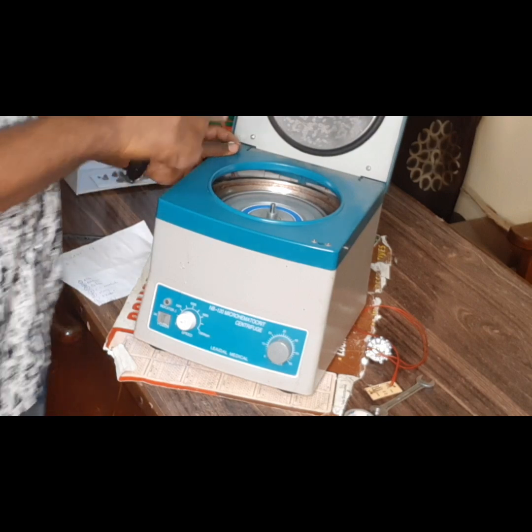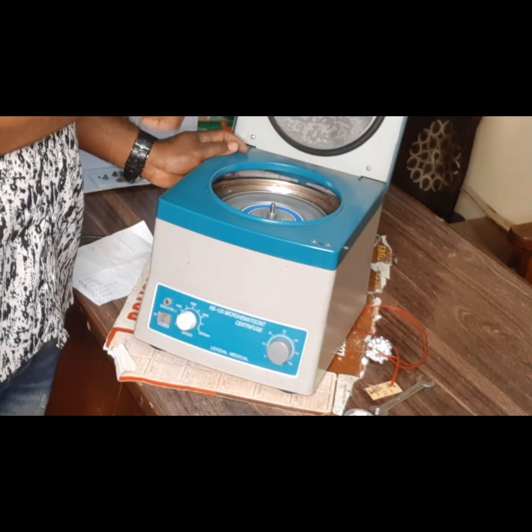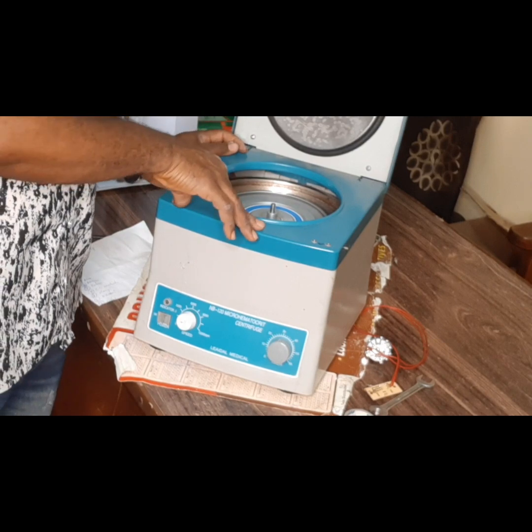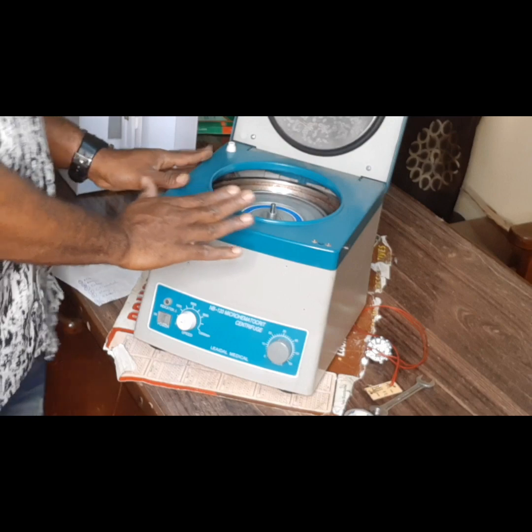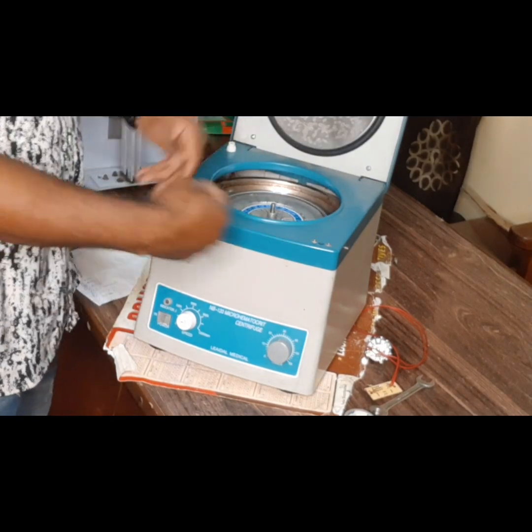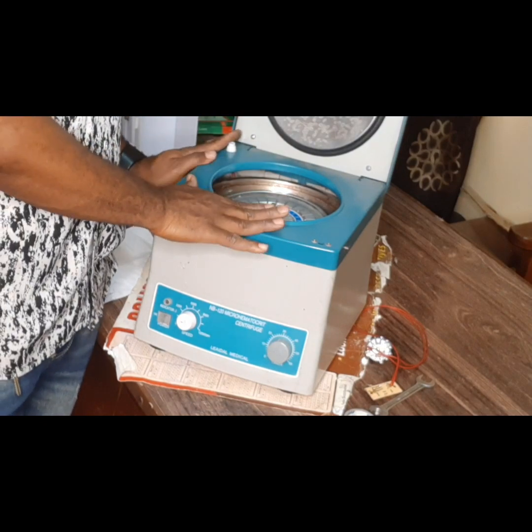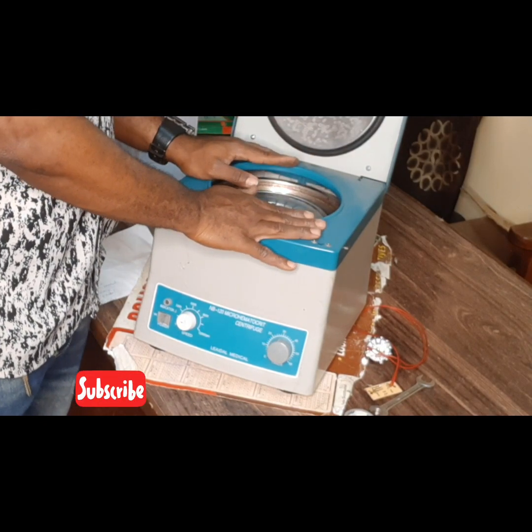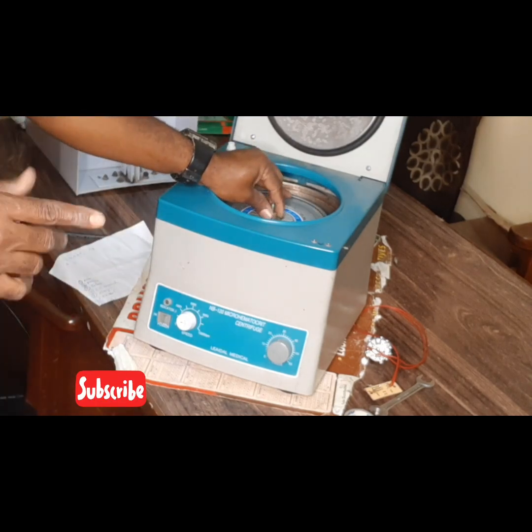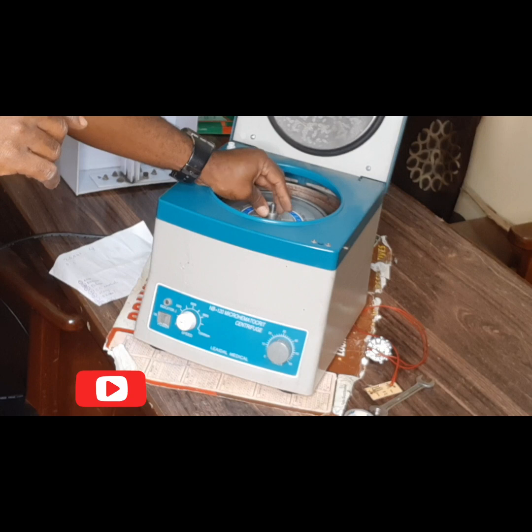So I need to find out why maybe it's touching somewhere. I need to find out what the fault is from. So it's touching somewhere, but we've been able to restore the machine. It's now working. So I am going to loosen it to find out the alignment. I think it has an alignment issue now, but we've been able to restore the machine to order. So this will be beyond the scope of our lecture today. That will be all for today.